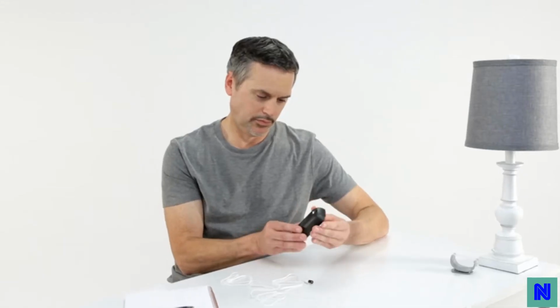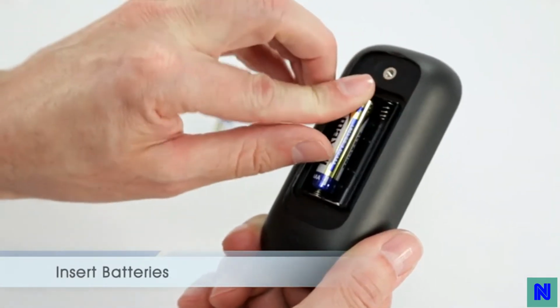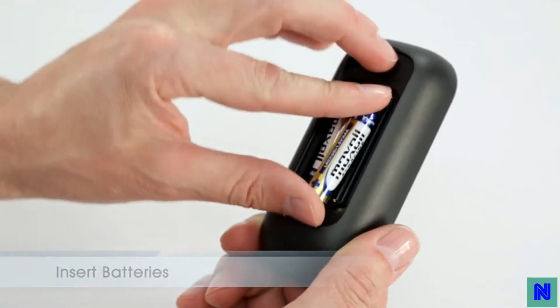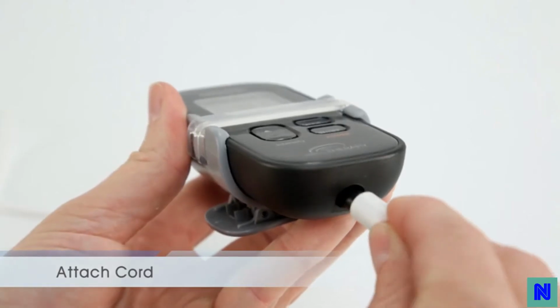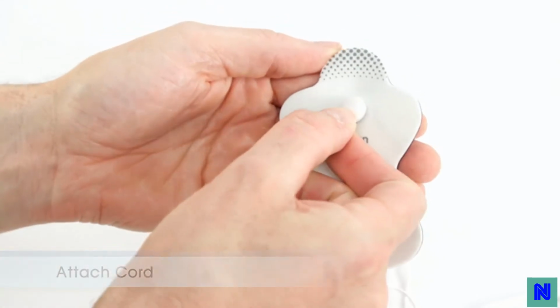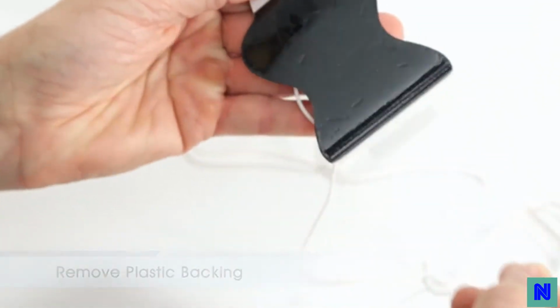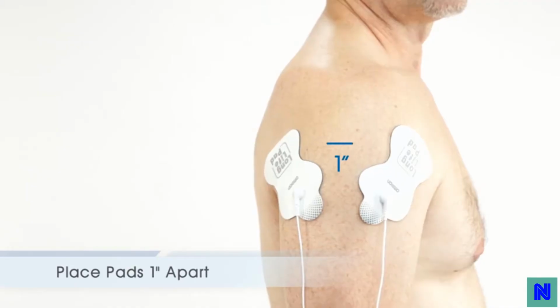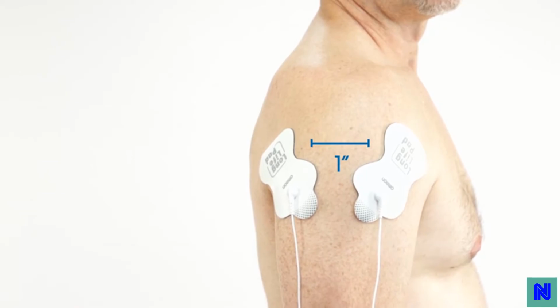Now it is time to use the unit. First, insert the batteries into the unit. Make sure the unit is off. Next, put the belt clip on and attach the cord to the bottom of the unit and to the pads. Remove the plastic backing to the pads and place both pads at least 1 inch apart on either side of the pain. Make sure your skin is clean and dry.